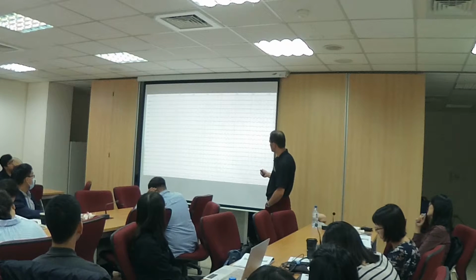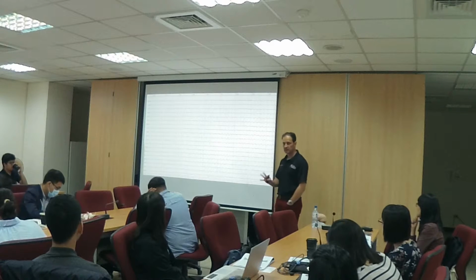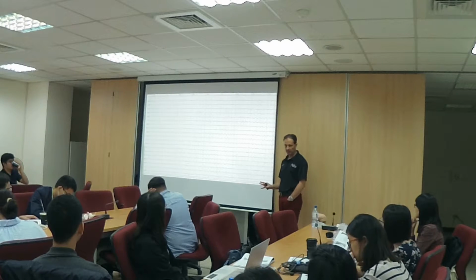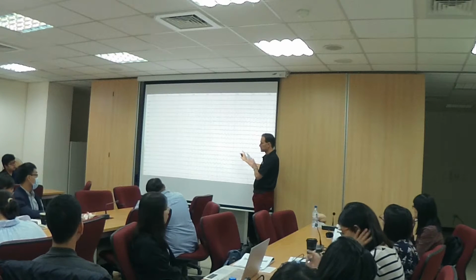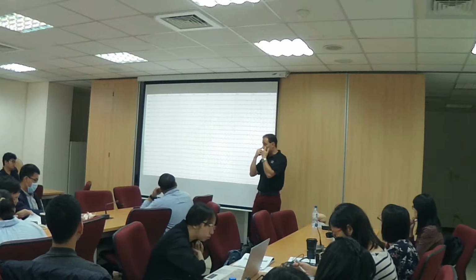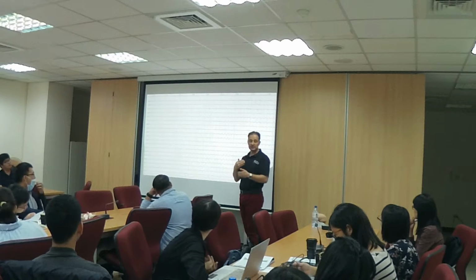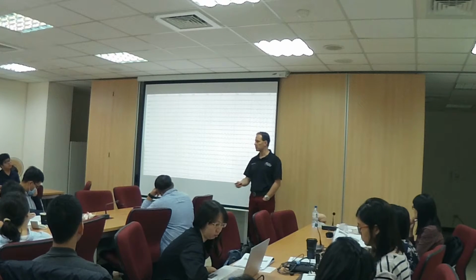So you can count the number of cycles in each second, and it gives you an idea of what rhythmicity is presenting at that particular point in time. This is just to give you a visual idea of what it looks like. And then when you embed them together in the EEG, you will train your eyes to identify them without filtering them. It just takes a lot of repetition.